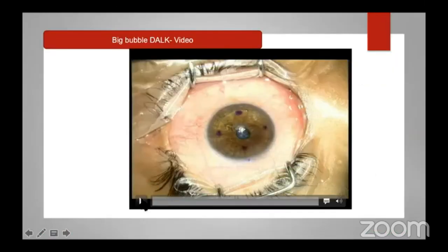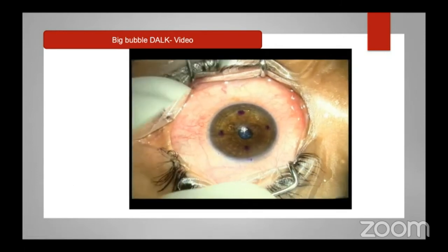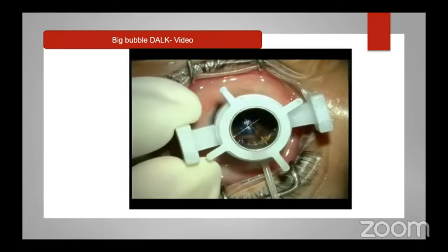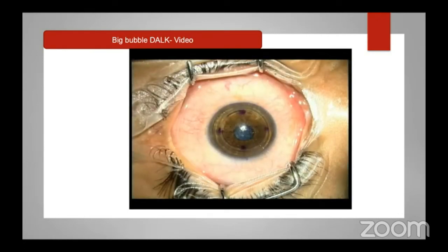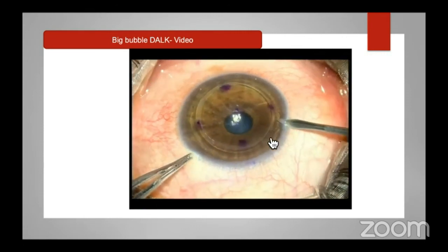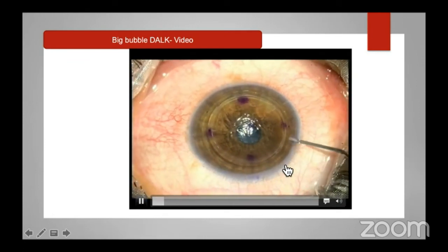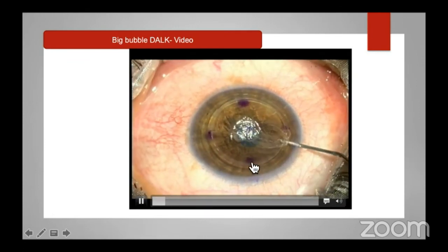What about doing a DALK? I think in all keratoconus, if you can achieve a Descemetic DALK, the results will be as good as full thickness grafts in terms of avoiding interface in these cases. Therefore, the big bubble technique is classically described. After having a 70 to 80% depth trephination, I do a little paracentesis and inject a few bubbles inside. There will be an indicator for big bubble formation.